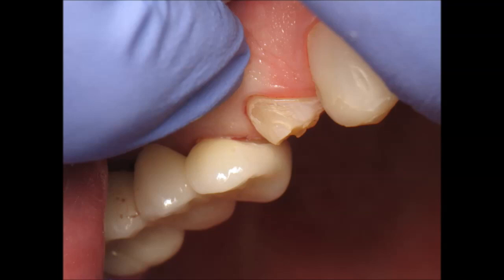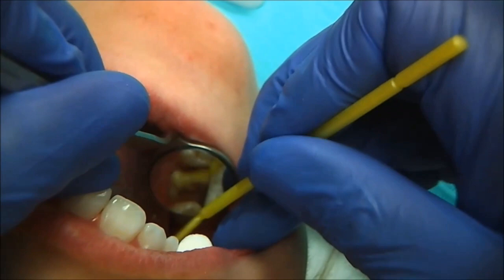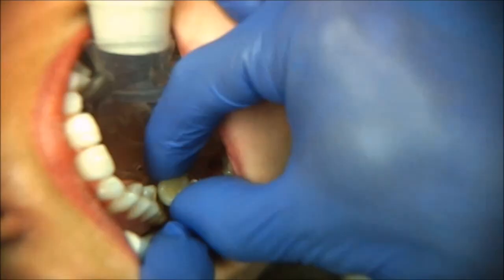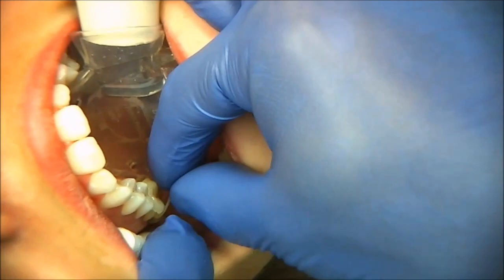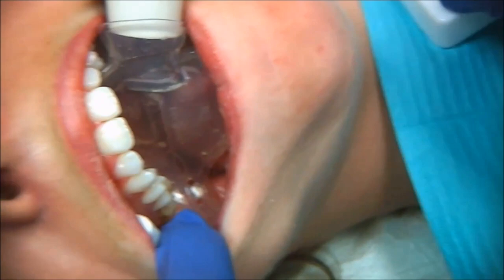A really nice trick that I've been using for many years now is compression — so simple. Compress the gum, compress the papilla. On the screen you see my finger compressing the papilla; you see some blanching happening. The beauty of that is once you compress the papilla, it just stops bleeding. It will stop bleeding as long as you're compressing the papilla, and that will allow you to resume your bonding procedure with full control of the bleeding.